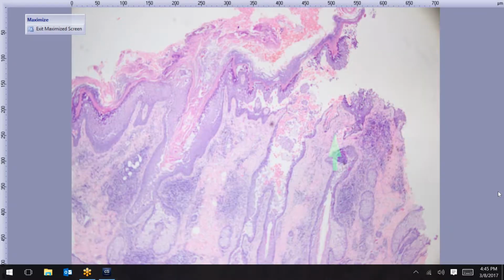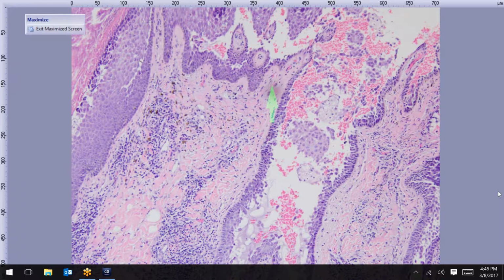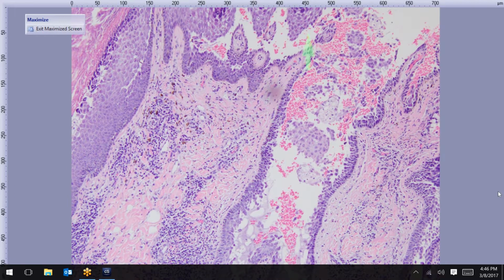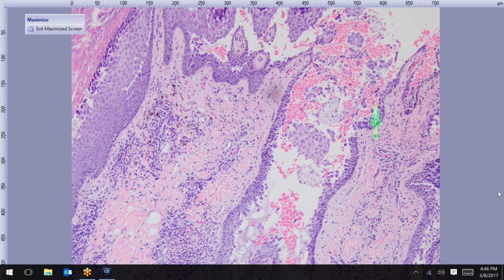This one's a little tricky. I think the pathology here might take you to potentially two different diagnoses. When you see this really almost suprabasal acantholysis here, really going into the follicular epithelium, this is something that you often think about pemphigus vulgaris doing this.